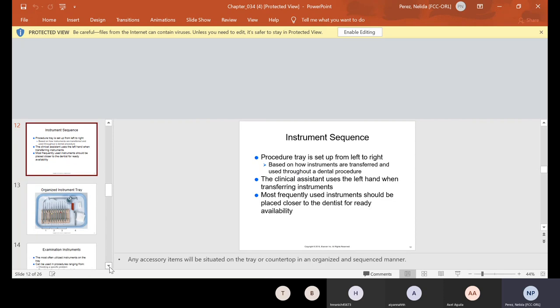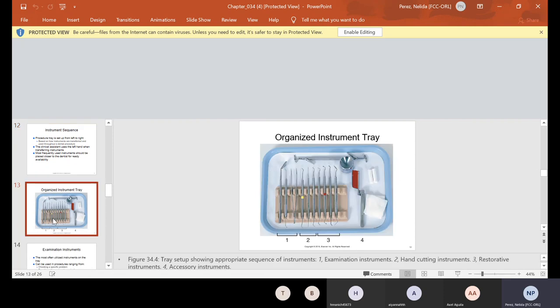So, here is the tray. And if you look at the tray, the first set here is called your examination. So that's your mouth mirror, explorer, and cotton plier.